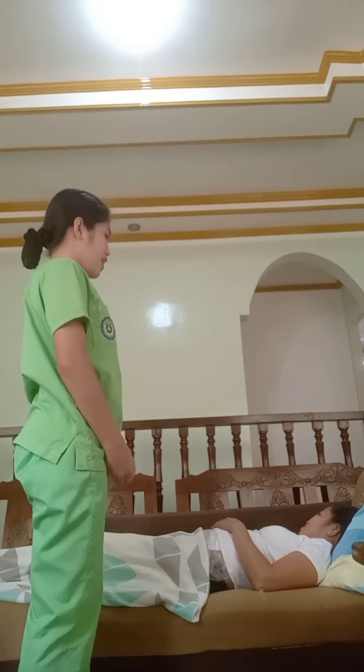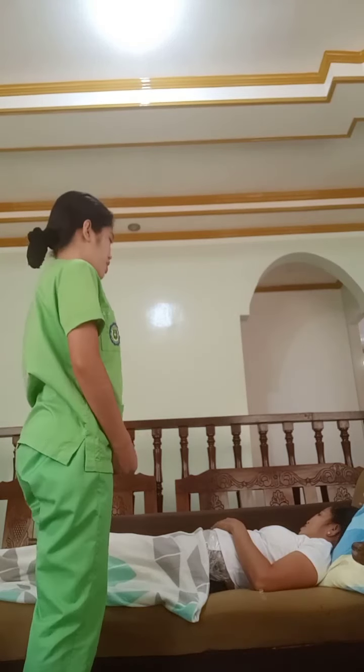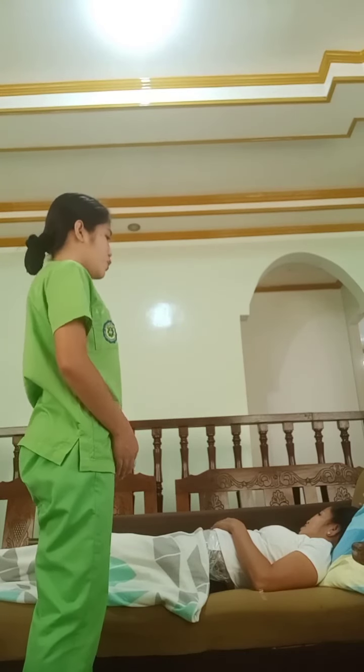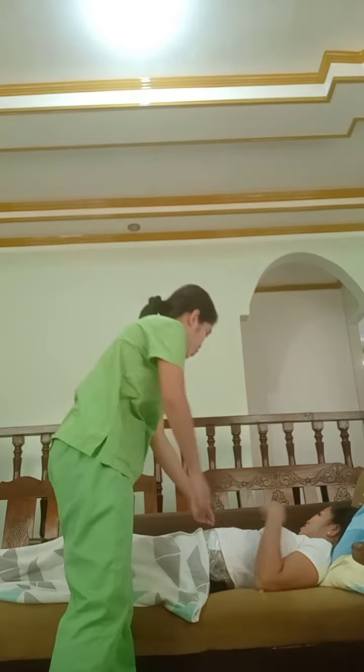So, good day. I am Charmaine Vidal and I'm going to perform colostomy care. This procedure allows nurses to assess and care for the peristomal skin as well as to obtain stool for analysis, and to promote comfort and prevent odor.